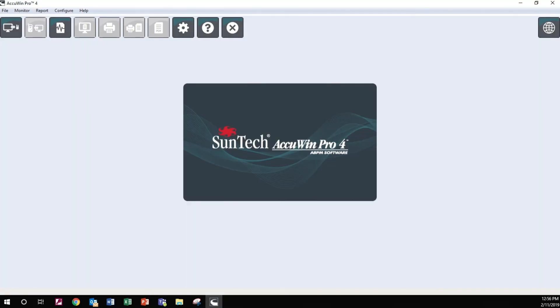AccuWin Pro uses Microsoft Report Viewer to create study reports. If you see a prompt to install this software, please do so.